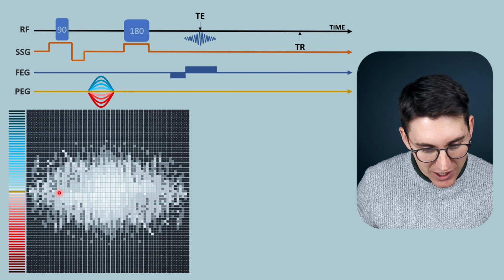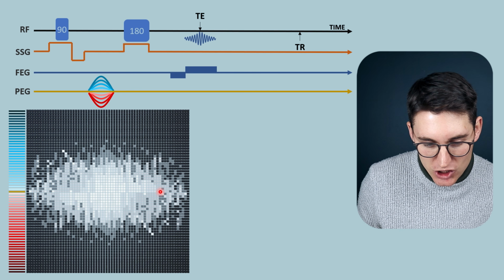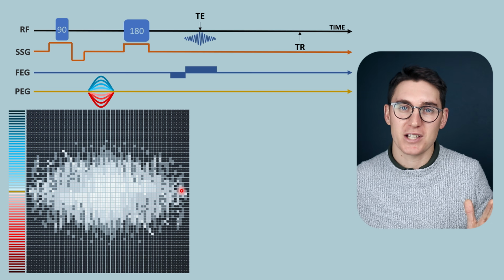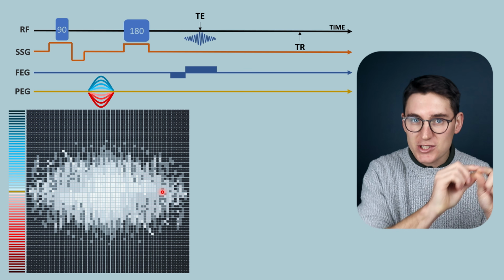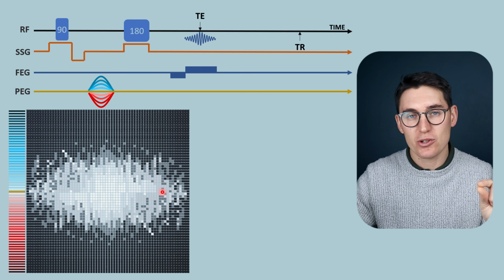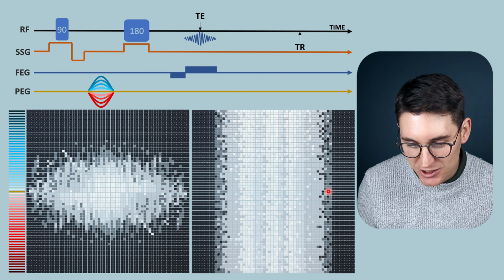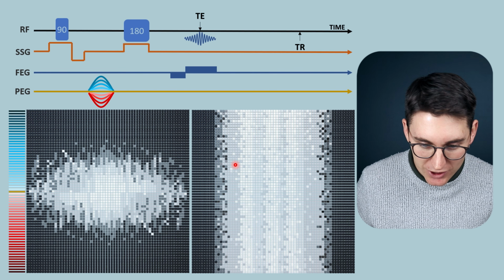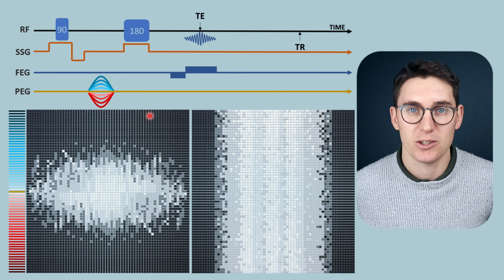Now each line of this k-space represents the net magnetization vector change over a given period of time. And we can use that one-dimensional Fourier transformation to take that data from the individual row and transform it into frequency-based or x-axis location-based data. And we can do that for each and every phase encoding step that we've used in our sequence here.